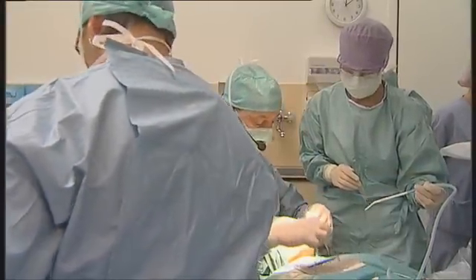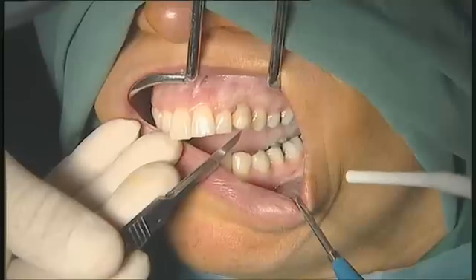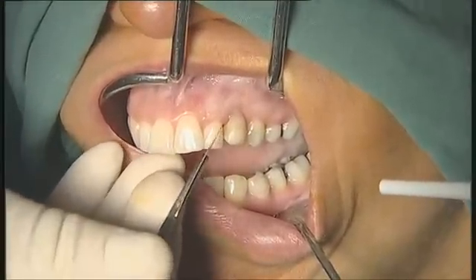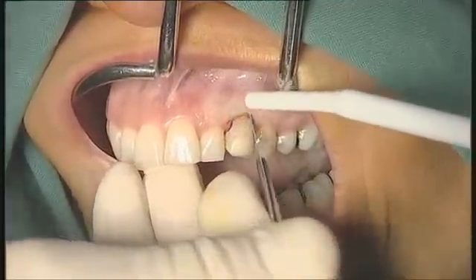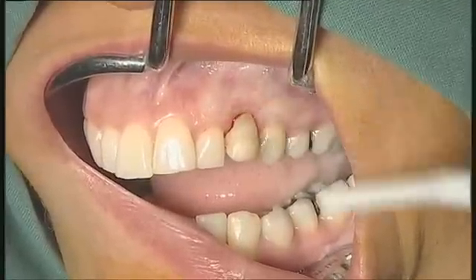This is the live situation with this canine which is slightly mobile. I am ready to gently extract it — that will not be that difficult. Now dive immediately.